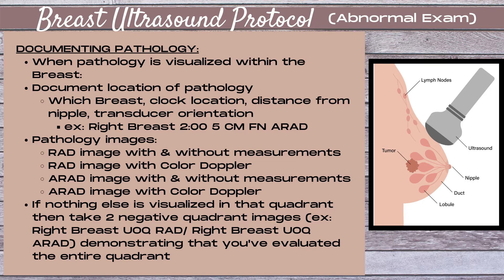After you've documented your pathology, you want to scan that entire quadrant around it to ensure you're not missing anything else. If nothing else is visualized in that quadrant, take your two negative quadrant images — for example, right breast upper outer quadrant radial and right breast upper outer quadrant antiradial — demonstrating to the radiologist that you've evaluated the entire quadrant.